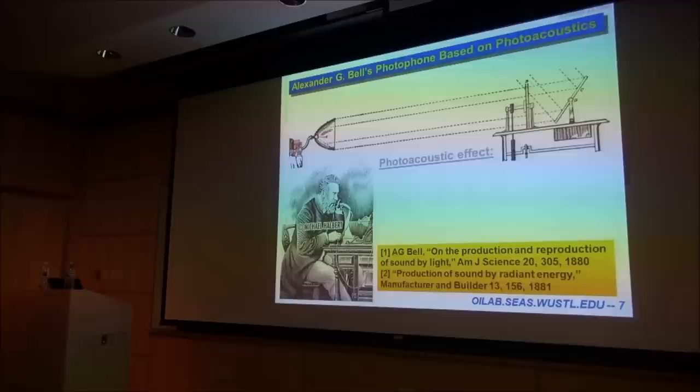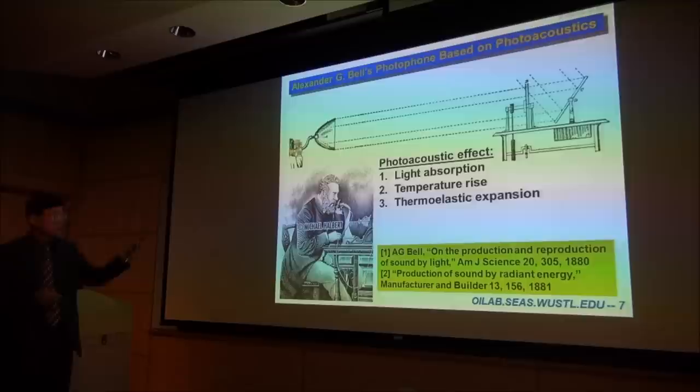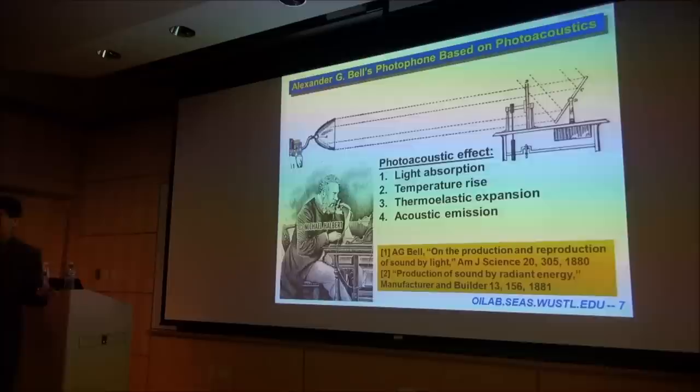In the photoacoustic effect, light is first absorbed. It generates a temperature rise. Due to thermoelastic expansion, you convert that heat into an acoustic wave. Bell was mostly interested in the audible frequency range, just to transmit sound. We are interested in the ultrasound frequency range. As we know, the higher the frequency, the shorter the wavelength, the better the spatial resolution.